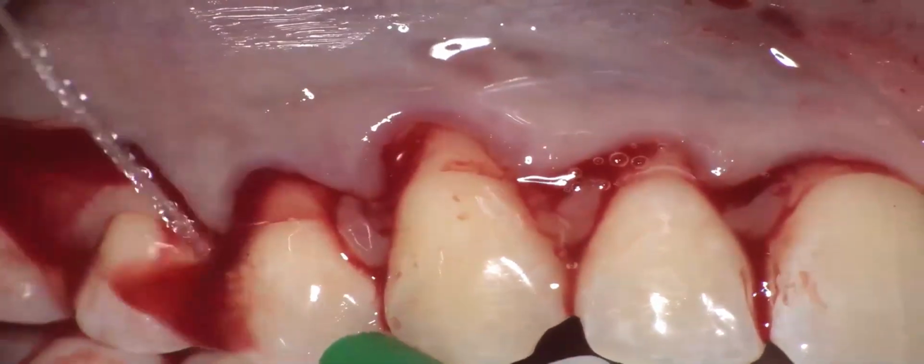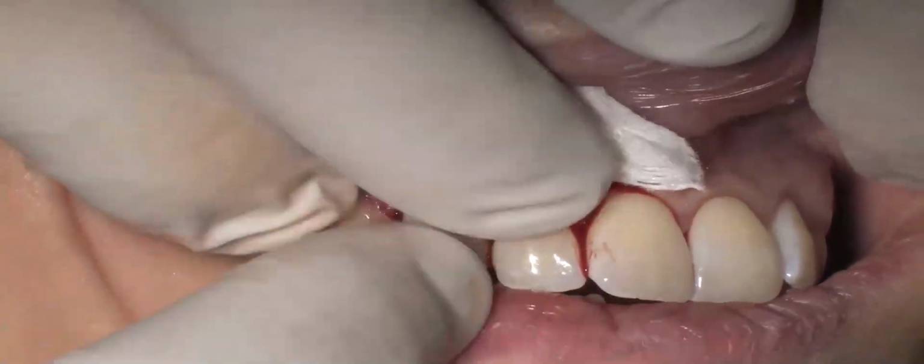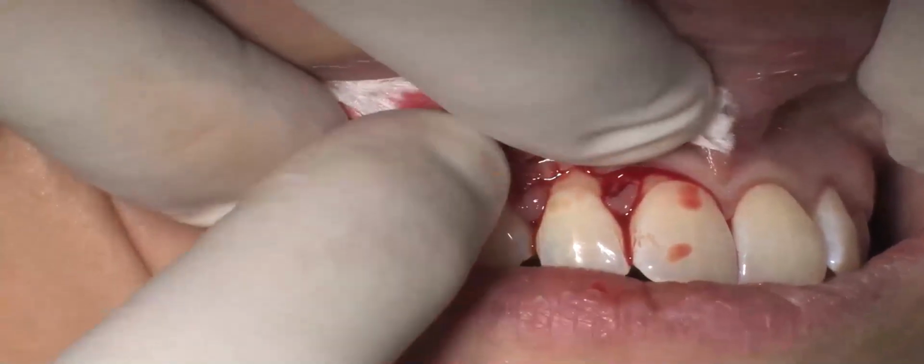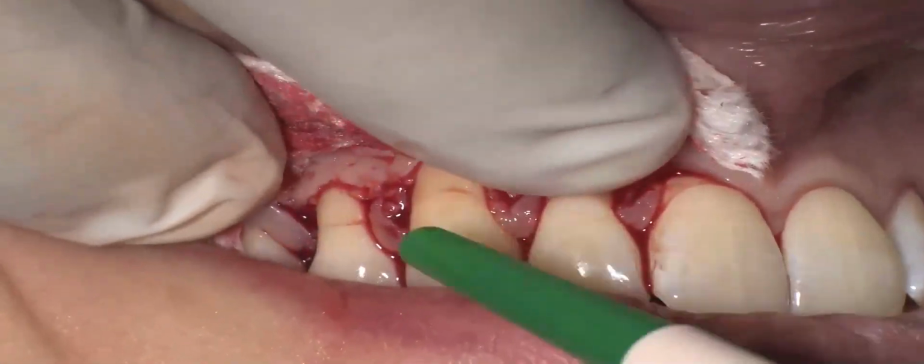that will be used to improve the vascular bed distal. But now this is the time where there is much more bleeding, so we take a gauze and start the compression with the fingers in the apical direction in order to expose the root and start with the root planing procedure.